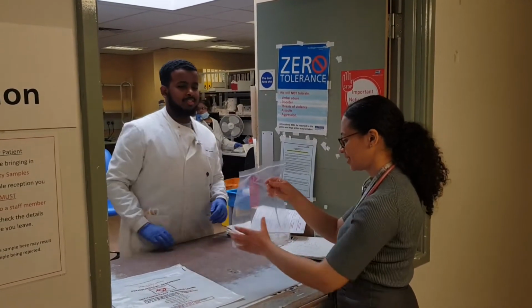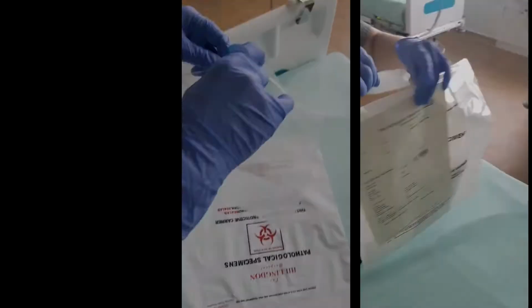Today we will guide you through the swabbing technique to obtain COVID samples for analysis.